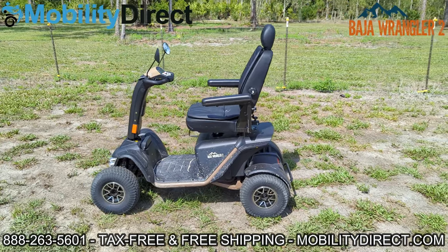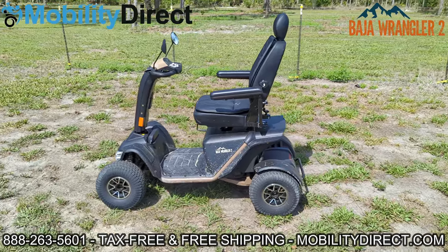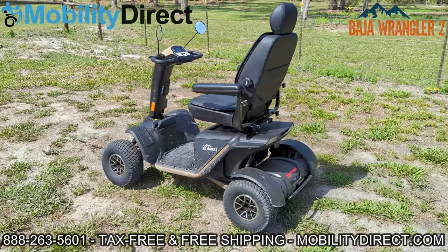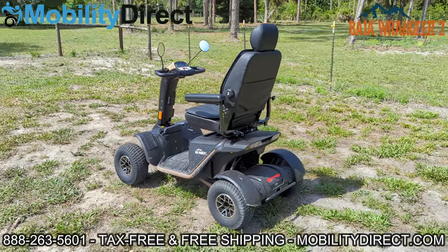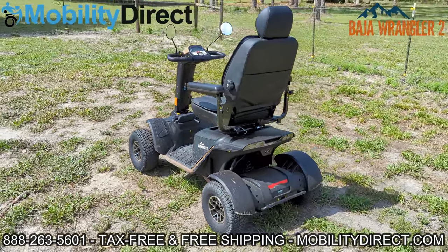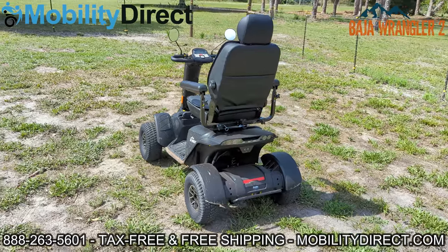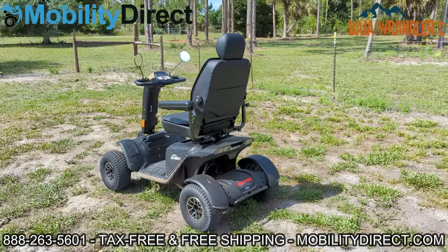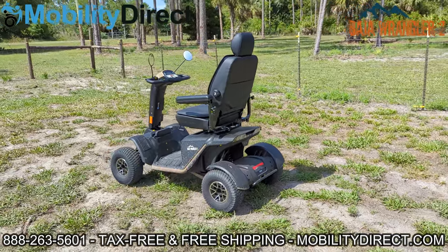Hello everybody, I'm Sergio with Mobility Direct and today I want to give you a personal first-person experience and some feedback on the Wrangler 2, which is by Pride Mobility. It's part of the Baja series. I am using this mobility scooter almost daily.